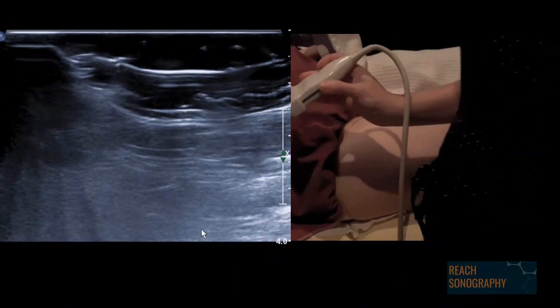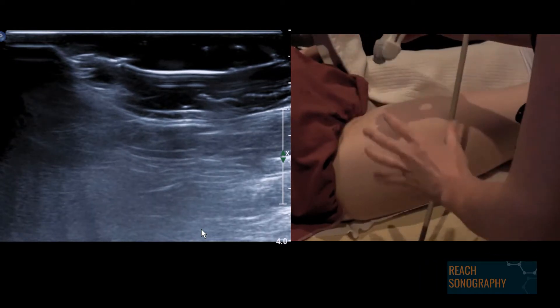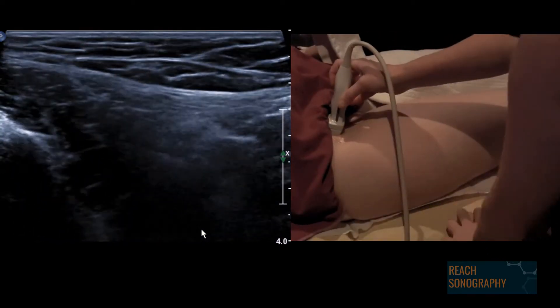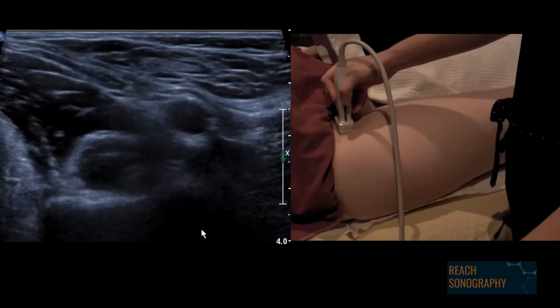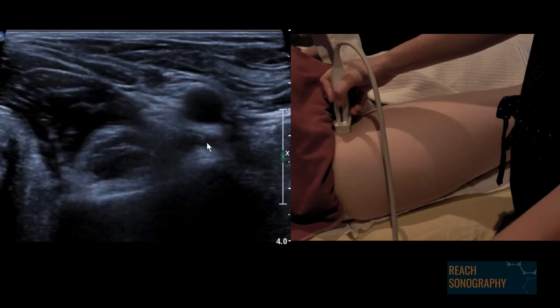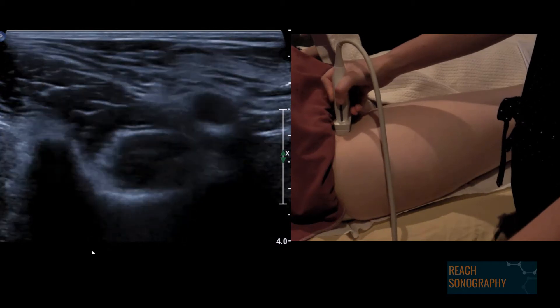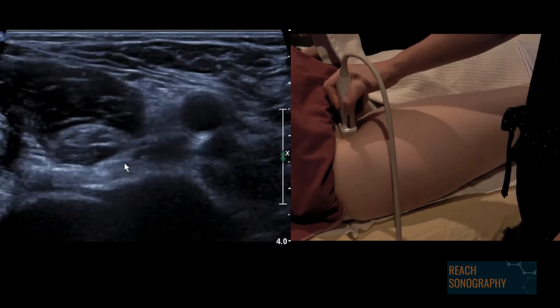Your body needs to be high because otherwise your elbows just run into their leg. If you've got a spare person to work the machine, just stand on the other side — it's a two-hands job. So there's the femoral artery, iliacus lateral fibers, iliacus medial fibers. That's too low — that's the femoral head. Going up, there's the iliopectineal eminence, and we want to be lower than the AIIS. This is our starting position, putting more pressure on the outside of the transducer to make the tendon nice and bright.